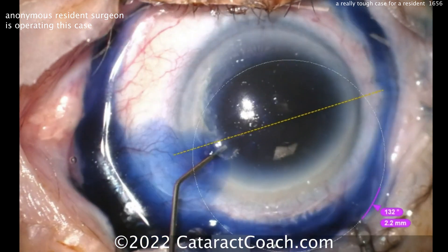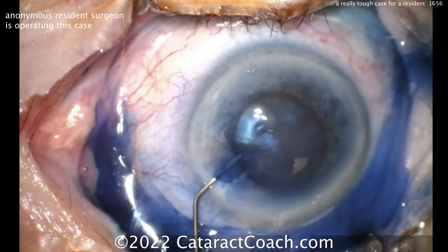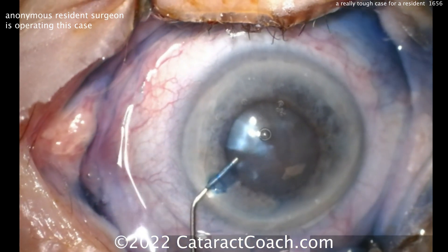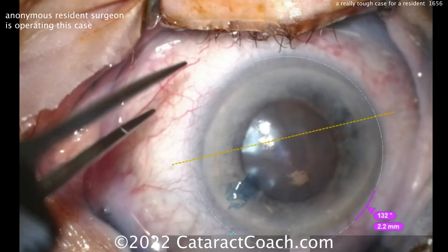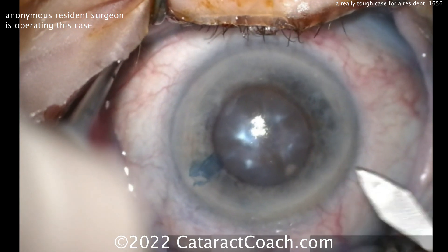This is about case number 200 for this young doctor in training, and you can see TriPan blue dye going in. With that small of an eye, though, keep in mind — that's not a 5- or 6-millimeter dilation. That's like a 4-millimeter dilation.